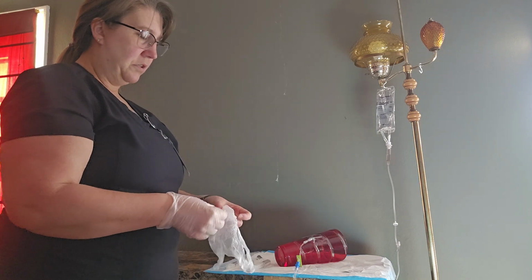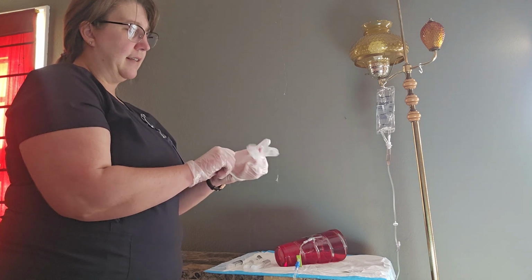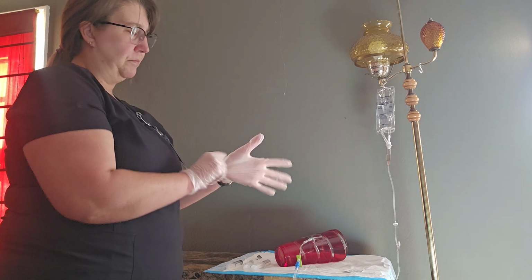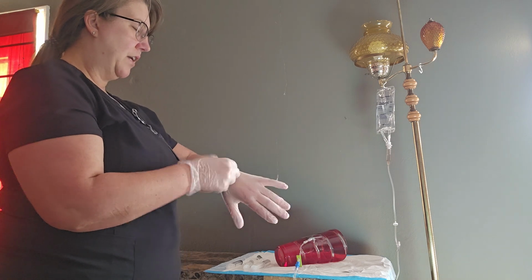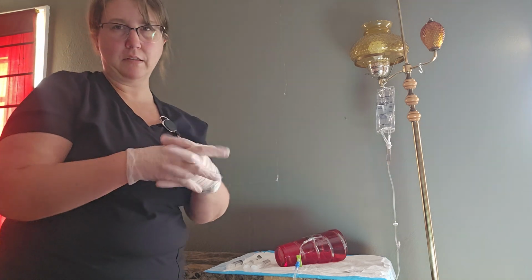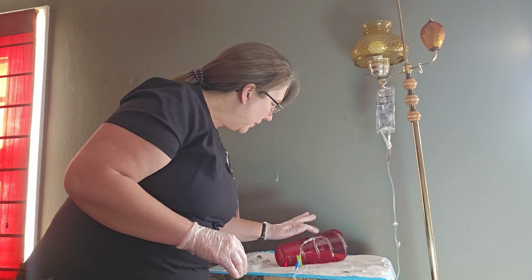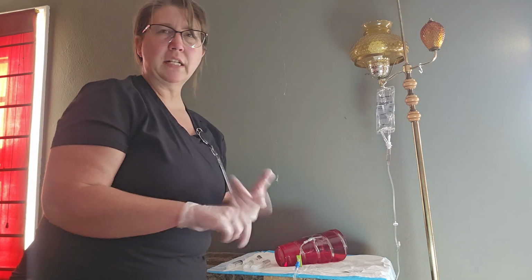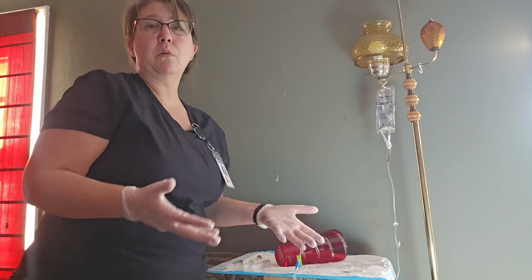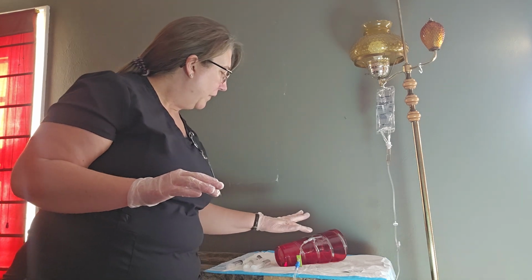Now, we also want to take a look at the site of that venipuncture, and that should be part of the assessment. We want to look at it, we want to palpate, we want to see if there's any type of irritation, any type of redness, any type of swelling, anything that's abnormal that shouldn't be there.